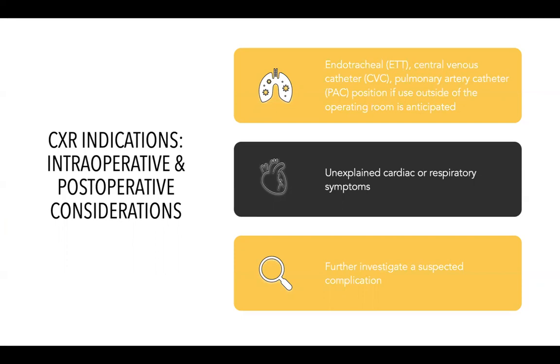One case of pneumothorax involved a subclavian central venous catheter malposition in which anesthesia providers cited reliance on the radiology department to report an error. These complications are examples of intraoperative and postoperative events that healthcare providers may have identified prior to patient demise had the healthcare team utilized chest x-rays properly.